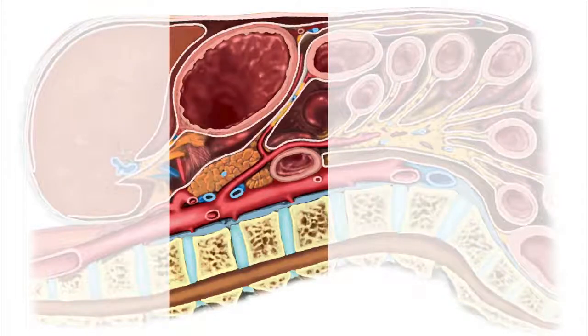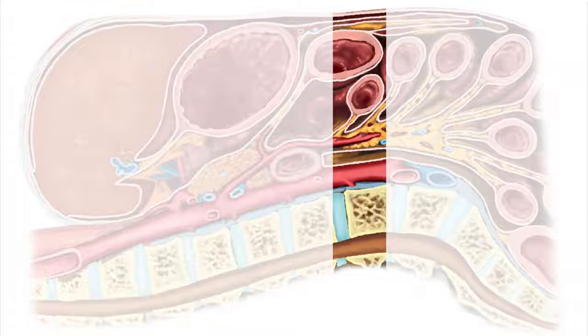The mid aorta is from the origin of the celiac axis until the SMA takes off and branches. So while the SMA is in view, you are in the mid-aorta. Distal aorta is after the branch points of the SMA until the bifurcation to the iliac arteries.